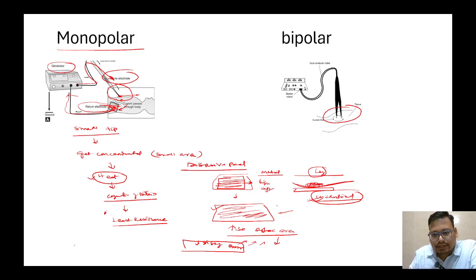To prevent this, now we have rubber foldable materials that will completely attach to the calf muscle. It will stick like a glue to the calf muscle. So there is an increase in surface area, and that will decrease the risk of burn.